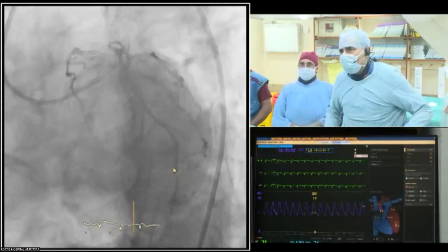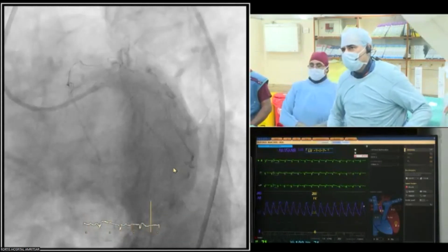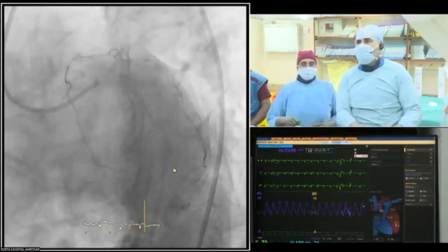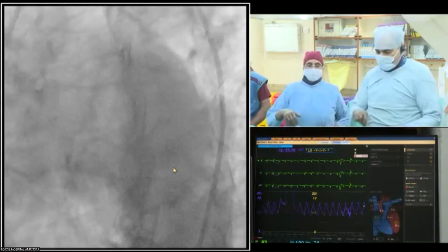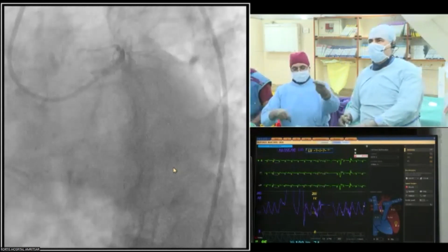Okay, I think that we are saying that it is good. Majority wins. So we pull out the wires, take final shots and come out. Yes, please. I think that's the consensus opinion. Actually, you are having a lot of support from the audience telling them not to do. Only few people are against, and VT you don't hear actually. He will make you more complicated, you know.